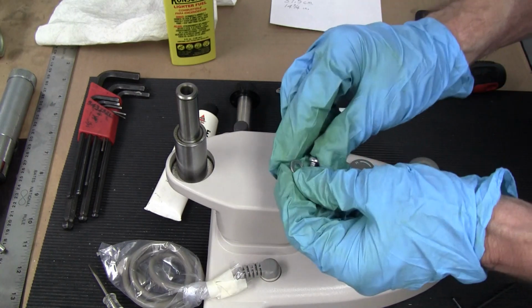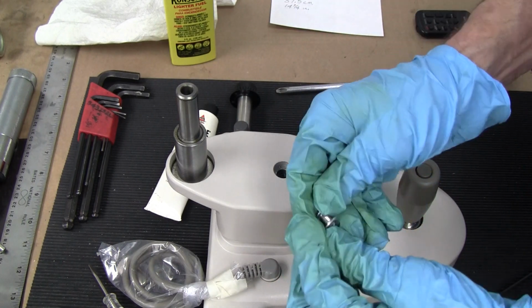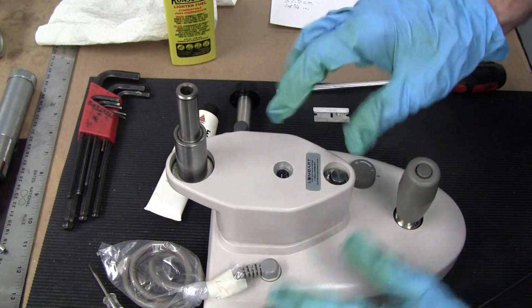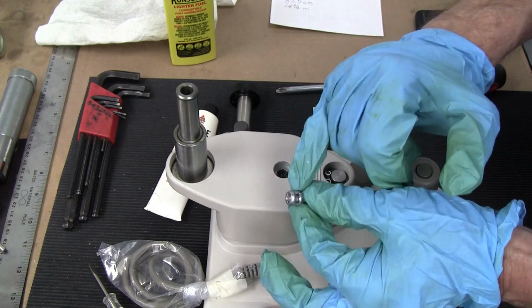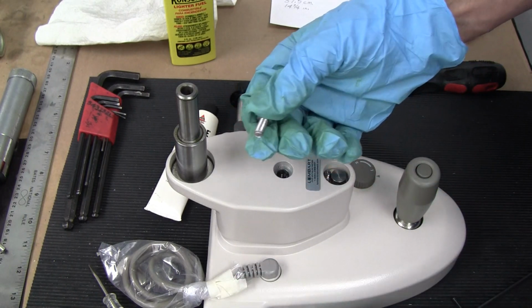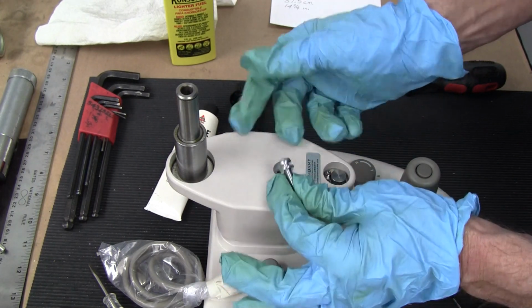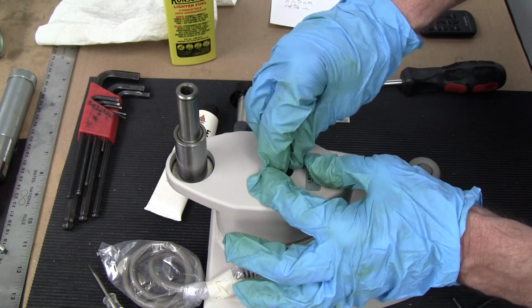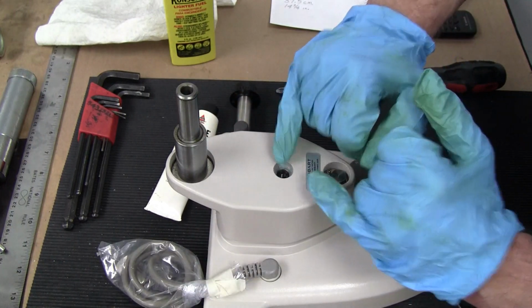And this often gets loose if I'm going up and down, because there's no lock washer on here. So what would be good is if you had a lock washer on your screw. You could either use the same screw and put a lock washer on it, or this is a longer one that I'm going to use, and it's got a lock washer on it. When you tighten it, that's going to keep it from getting loose again.